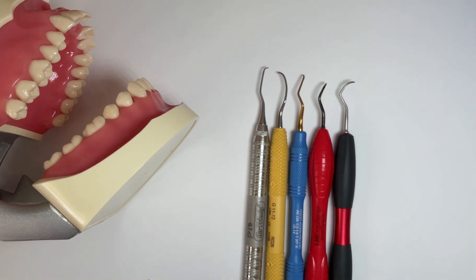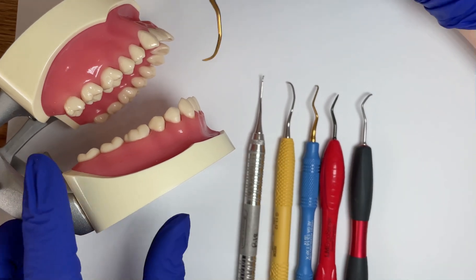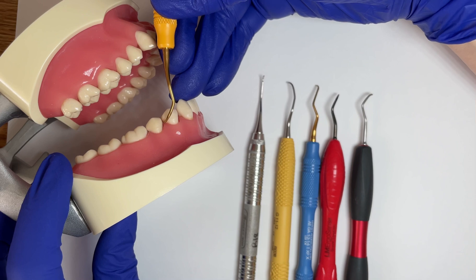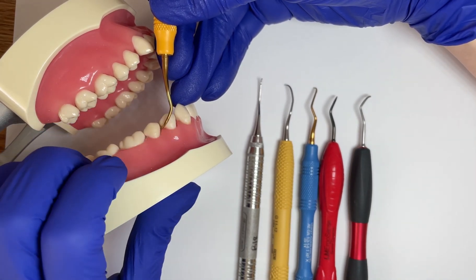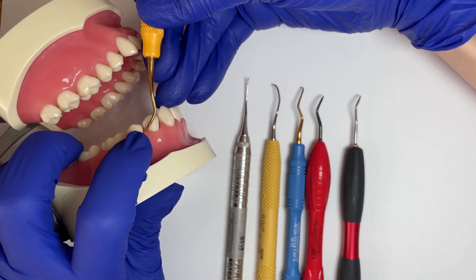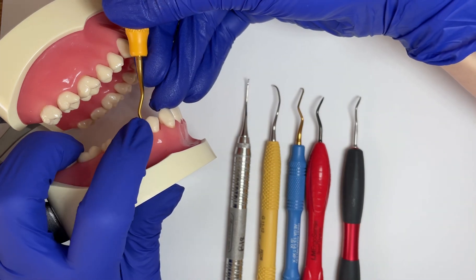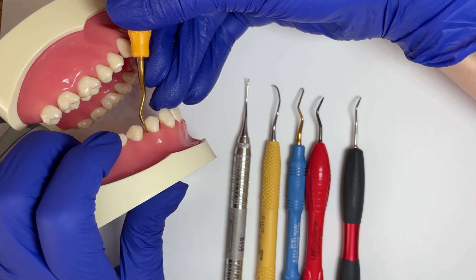For example, if I'm working on a tooth and trying to determine the correct working end, I look at the lower or terminal shank. With my fulcrum established, I can tell this is not the correct working end because my shank is coming across the tooth. I want my shank to be parallel to the long axis of the tooth to determine the correct working end.